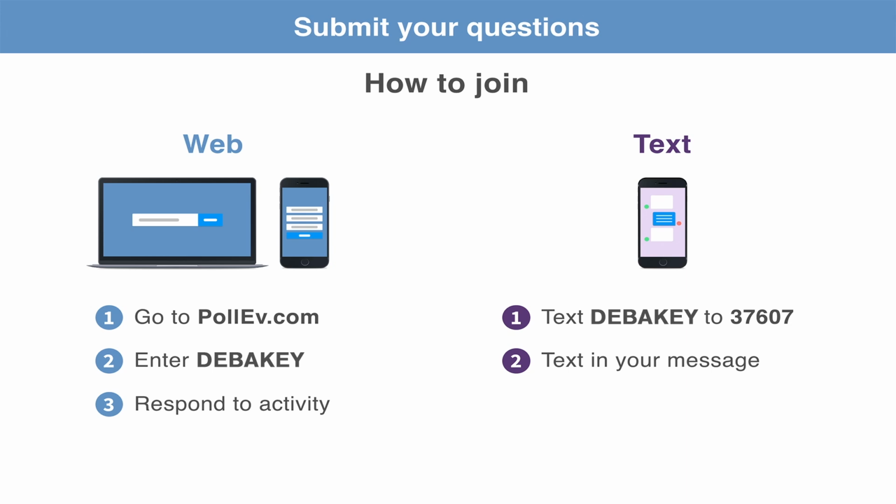I really wanted to thank you for that question, and I wanted to show you some really cool pictures. I hope you guys are going to like this one. Okay, can you go back on my screen?